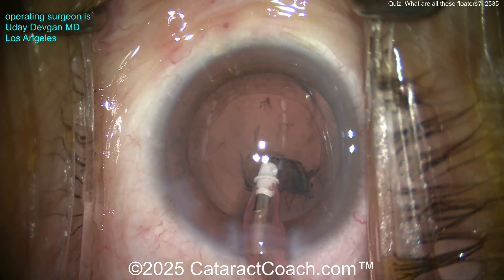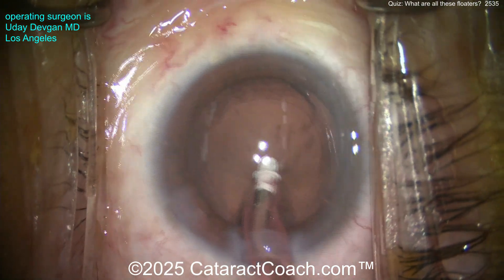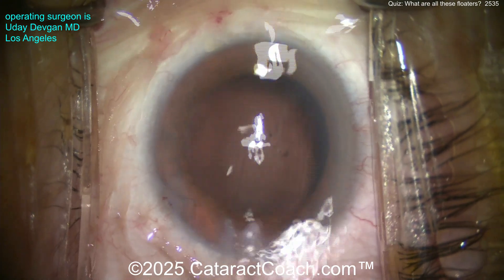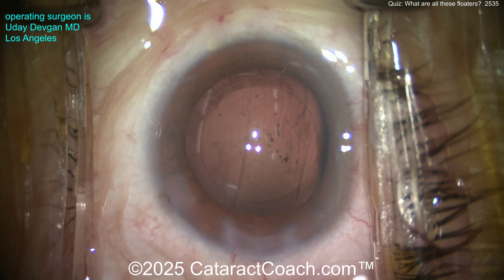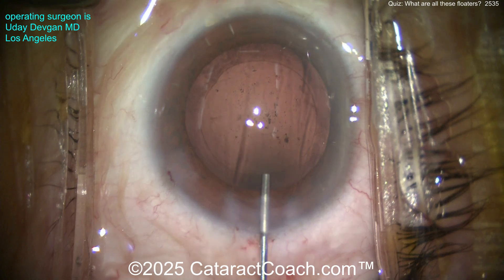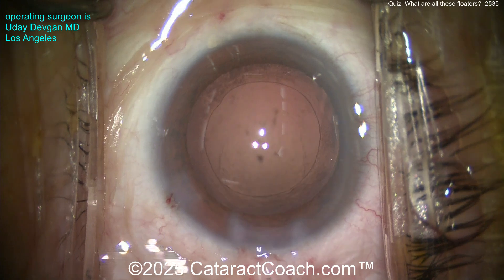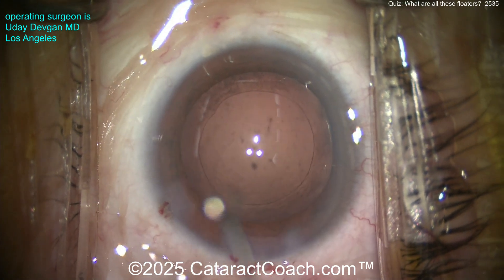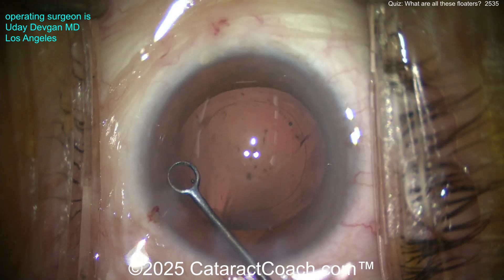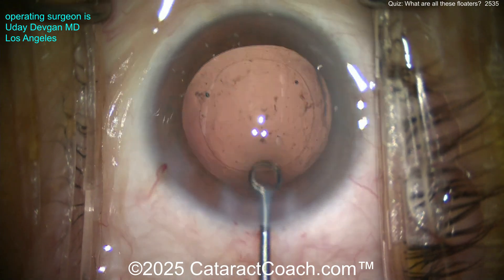Removing the lens cortex — look back there, what do you notice? The cortex comes out pretty easily. Cleaning up the little material on the lens capsule, but look behind the lens capsule — look in Berger's space. What's all that? That is lens material, tiny fragments of the cataract that got broken up and went through the zonular weakness. The gaps or looseness in the zonular support means they can go back there.